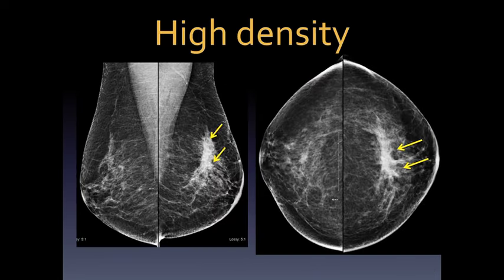Grouped distribution is a smaller distribution — typically five or more calcifications within a two-centimeter area. These small calcifications are tightly grouped, in this case less than one centimeter, and can be associated with malignancy in a third of patients. Here is a case where the patient was not recalled for biopsy, and two years later had high-grade DCIS. This patient had been recommended for biopsy but refused, demonstrating the natural history of these calcifications progressing to high-grade DCIS over two years.